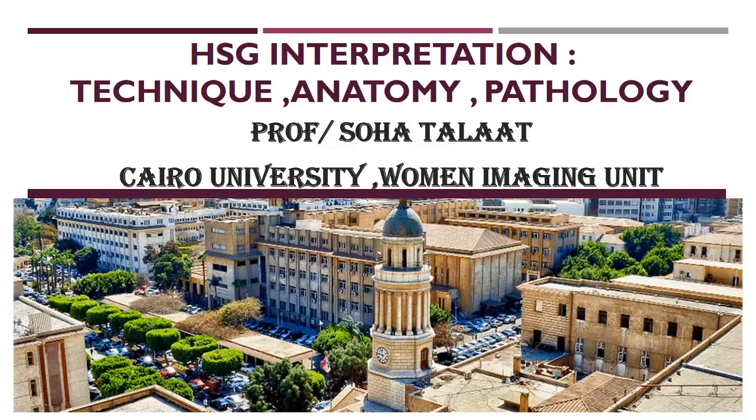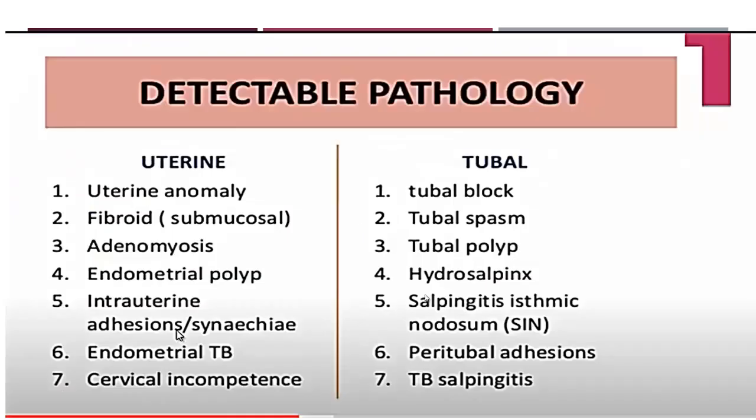Bismillahirrahmanirrahim. This is part 2 of the lecture, the pathology. Regarding the detectable pathology on hysterosalpingiography, either we can detect uterine pathology or tubal pathology.